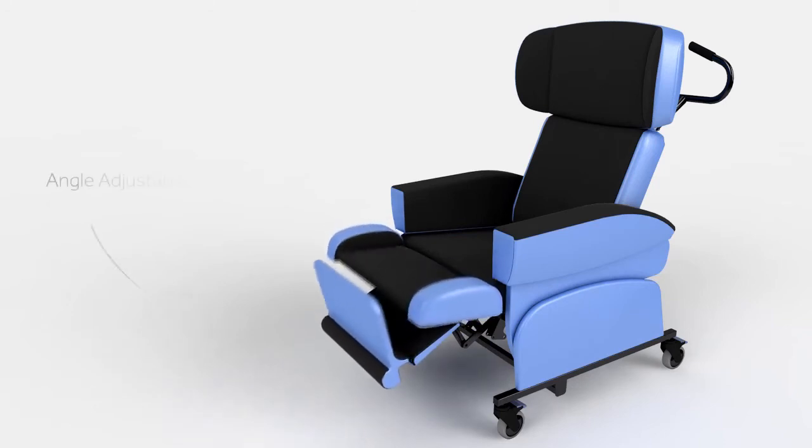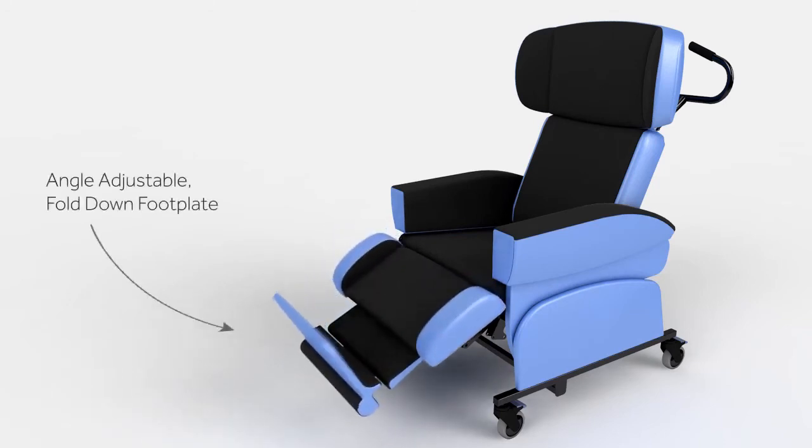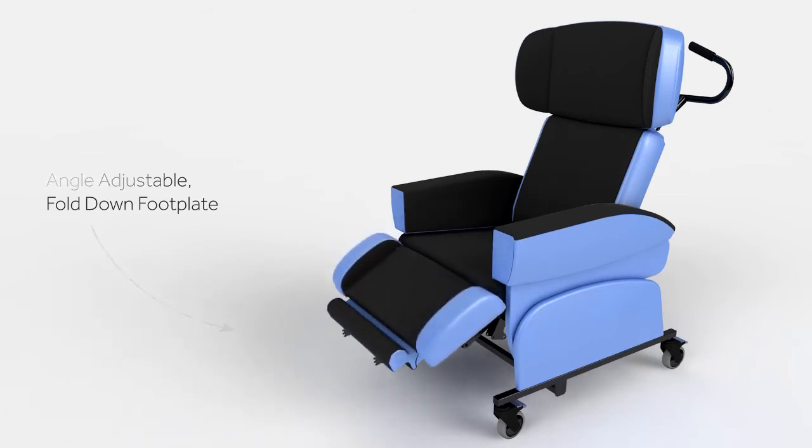The footplate is simple to use. Lowering, adjusting the angle, and stowing the footplate can all be carried out from one side of the chair.